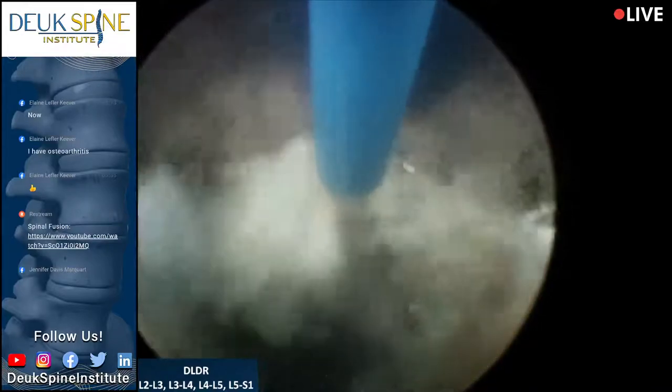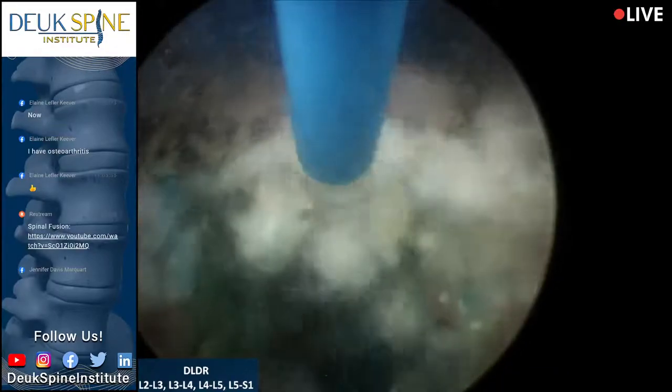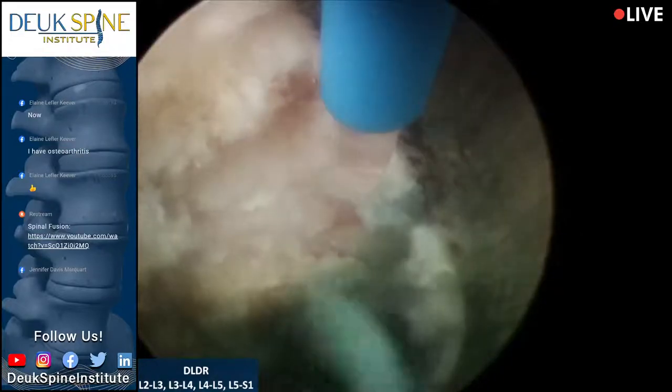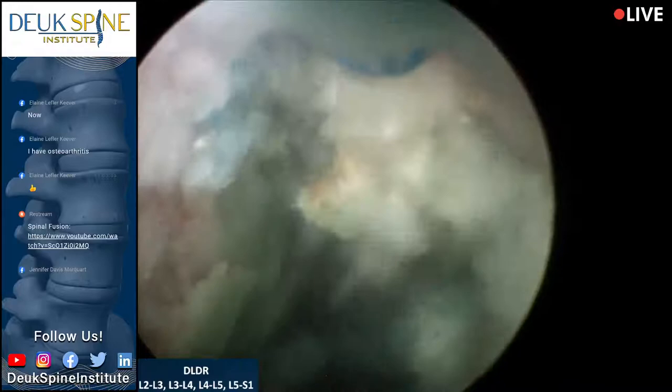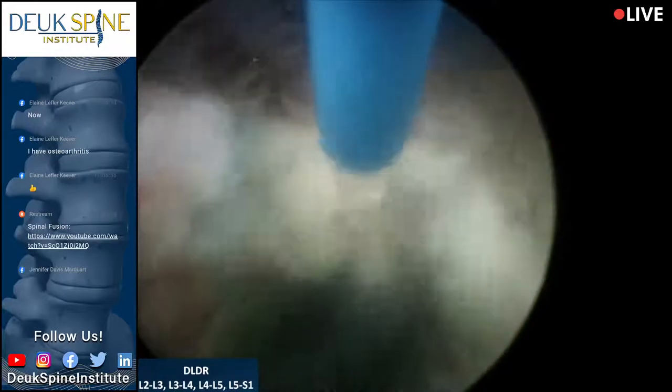Everything okay? Just about done here, guys. And then we got the 5-1 and we'll be done. Just about done. About another 30 seconds. I'm looking lateral here. By the way, that pink thing is the end plate. That's the bone, the vertebral body end plate. That's what abuts the disc.